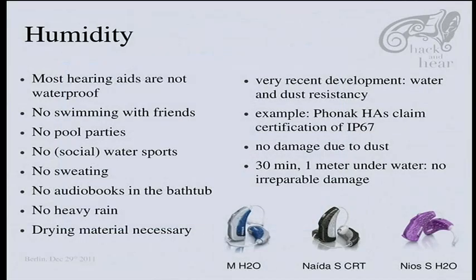A problem with hearing aids is humidity, actually. So most hearing aids are not waterproof. That doesn't sound so bad, but actually a lot of things are related to that. So that means no swimming with friends, no pool parties, no water sports where you have to talk to someone. Sweat is a problem, especially for people who do a lot of sports. No audiobooks in the bathtub, no heavy rain.